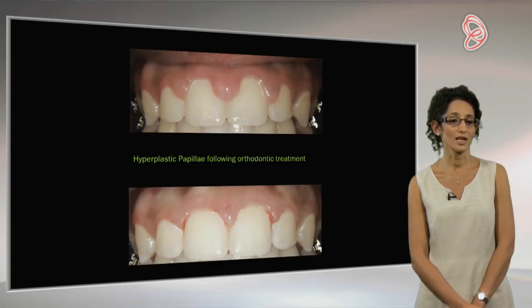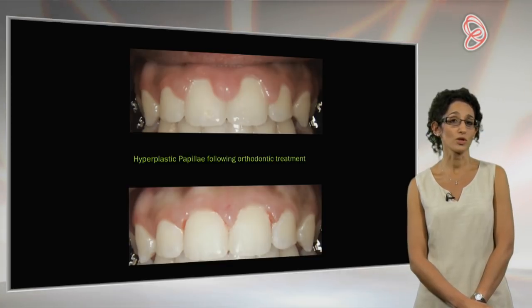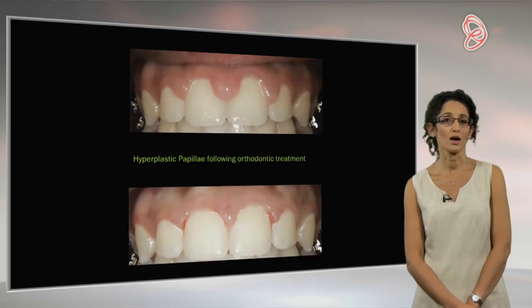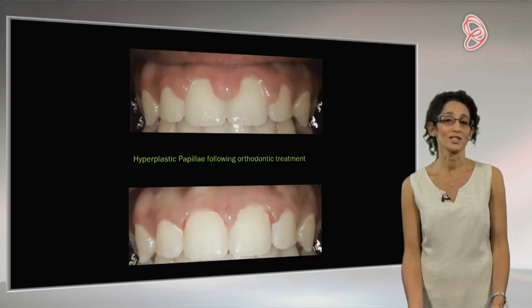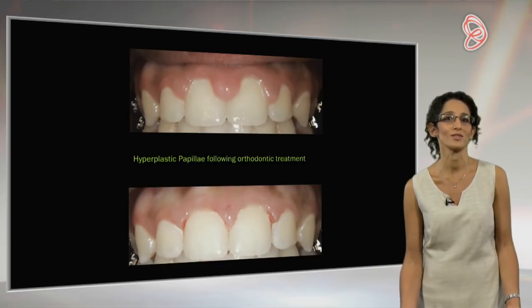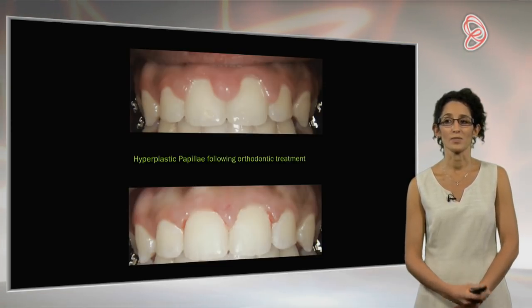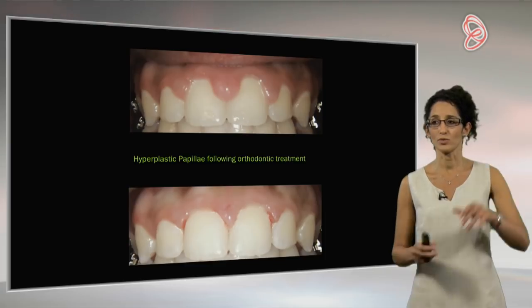So this is how he left the surgery. I get them to brush this straight away, but you can see a lot more of his teeth showing, and after he's had all his lovely teeth straightened, we want him to have a confident smile. He did have quite a gummy smile as well, you can see that. So a delighted patient.